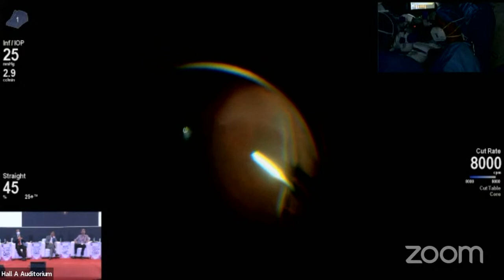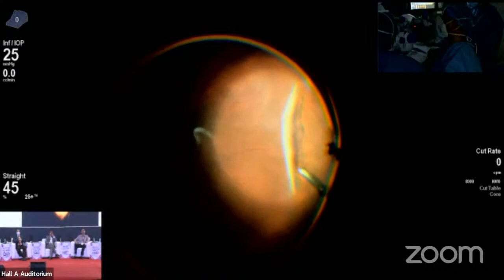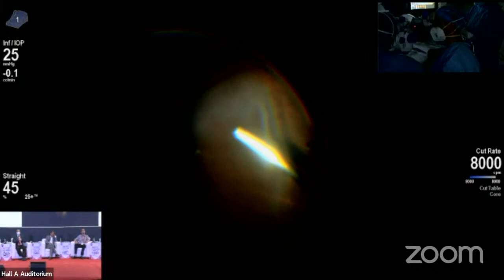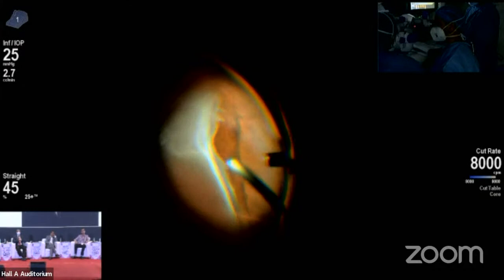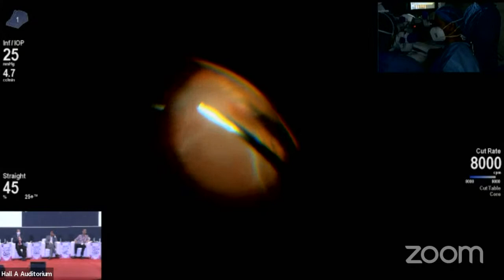So you can see, this is the tear which is present temporally. I hope you can see it clearly, sir. Yes, yes. Like Dr. Vinod is demonstrating, it is very essential to remove the vitreous attachments around the tear, especially the horns and the posterior margin also, if it is attached there.